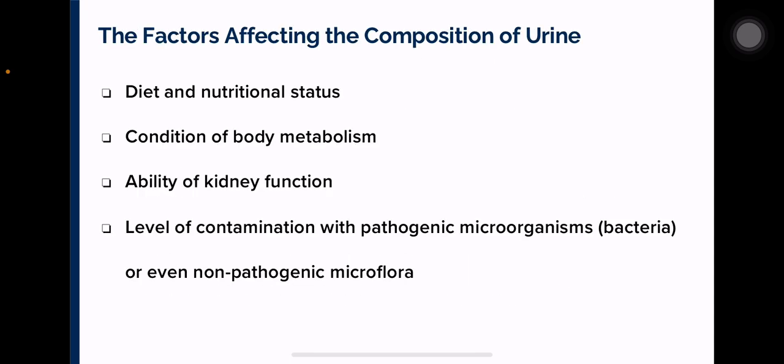So urine composition changes with diet and nutritional status, metabolic conditions, kidney function, and contamination such as bacteria or the microflora. When we talk about microflora, these are the normal microorganisms or bacteria residing within us. So these factors remind you to consider both pre-analytical factors as well as patient history when interpreting results.